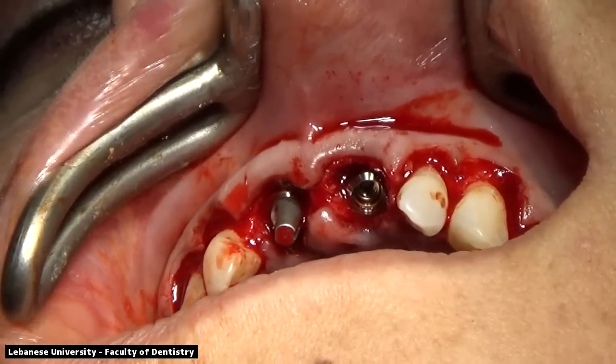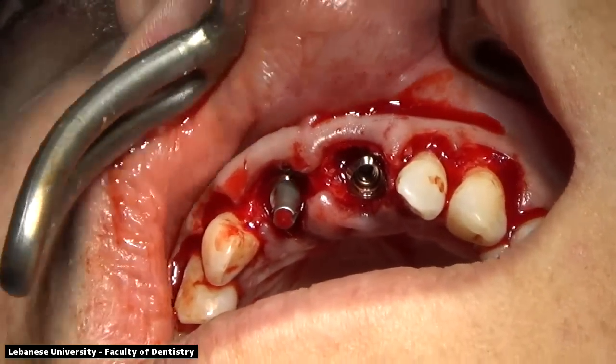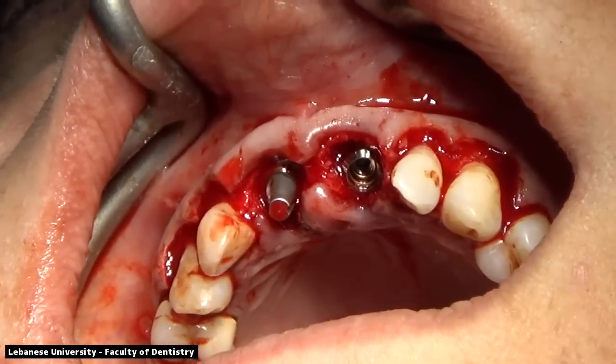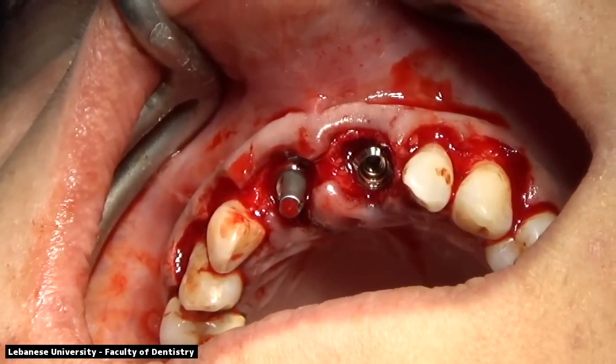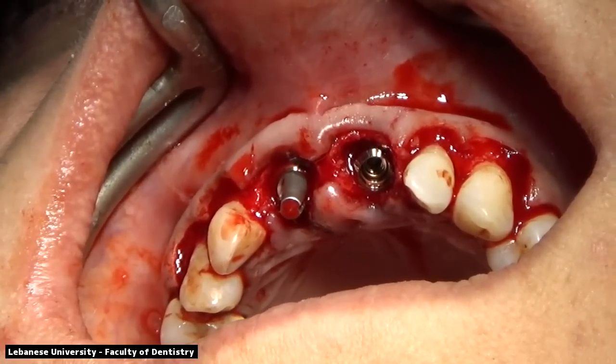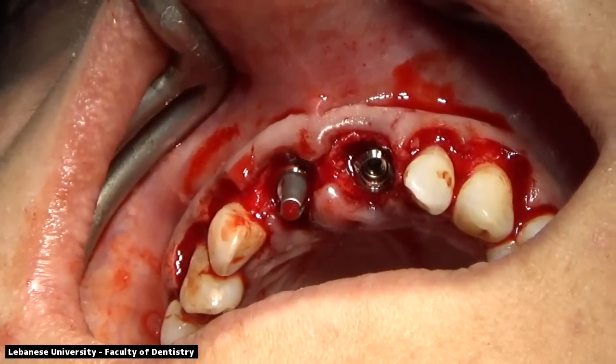When we were doing our drilling, the right socket was 8 millimeters in length from the coronal aspect to the apical aspect. So while doing the drilling, we went to 13 millimeters using the buccal plate of bone, the crestal portion, as a reference. So the drilling sequence has to be deeper than the socket itself so that we can engage in the apical portion of the socket.